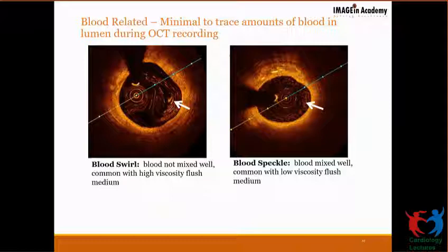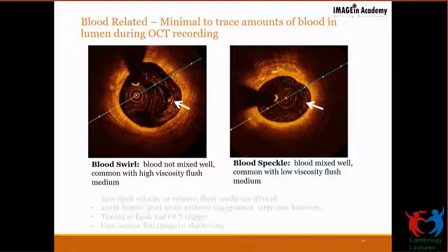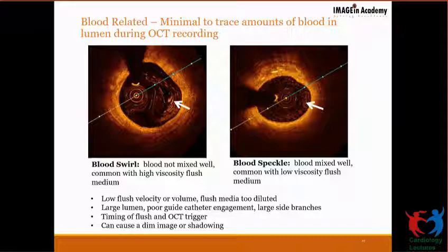This is not the case with IVUS, because IVUS has a very large wavelength. The sound wave has a larger wavelength, and it's able to overcome the filling defects caused by the RBCs. So you need to flush, you need to see that your guide is coaxial, you need to inject at the right intensity, and you need to push the contrast well.